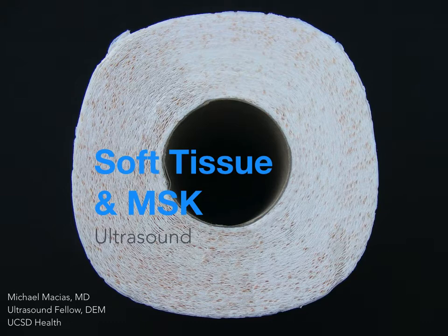From the diabetic with redness to the groin region, to the avid wrestler who popped out his shoulder, to the painful swollen joint. This category is defined by a broad range of diagnoses that you can use ultrasound to assist with. Not only can ultrasound be superior to alternative imaging in some cases, it's much cheaper, less time consuming, and can help you make a definitive diagnosis or at least increase your clinical suspicion for a different clinical diagnosis very rapidly and at the bedside.